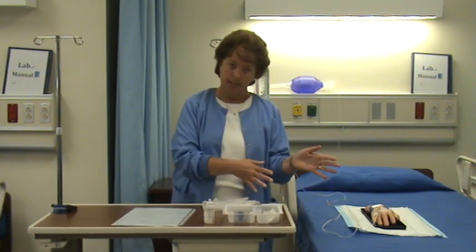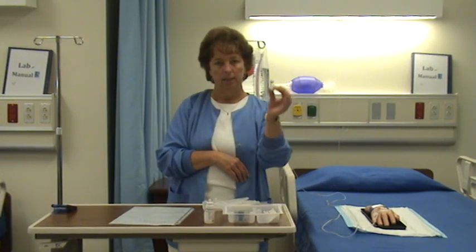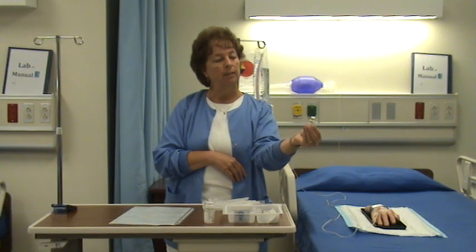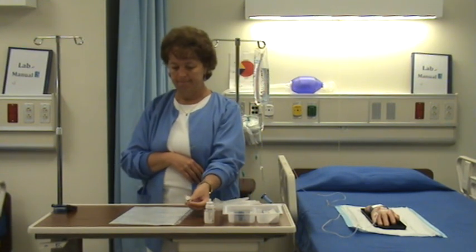So I go to my MAR or order, and then to my medication and pick out my Lasix. This is a single dose vial, and it's 20 milligrams per 2 milliliters. So I'm going to give the complete vial of this. So I do my first check.